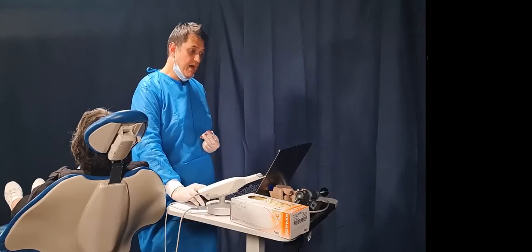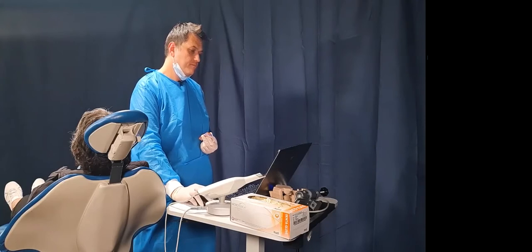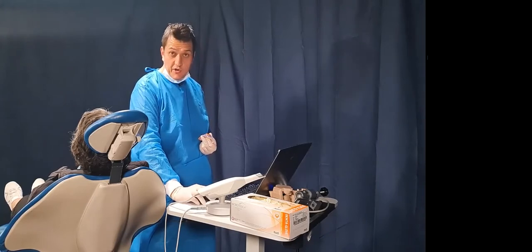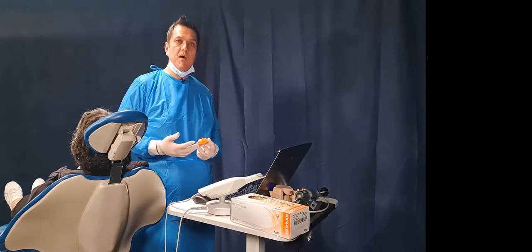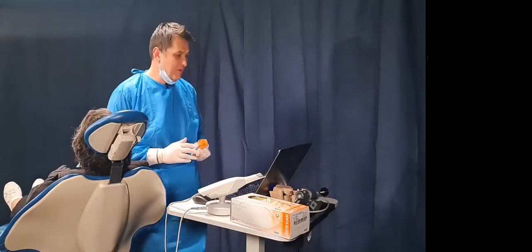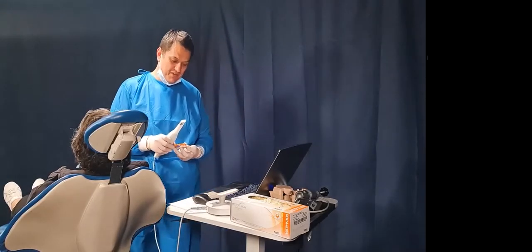I'm just going to delete my upper scan. Okay, and I'm going to select the reference denture icon on Trios. Now, I believe that the scanner is optimized for the indication that you're doing. So it is a good practice to actually follow the manufacturer's recommended protocol. So I've selected that now on our screen, and I'm going to start to scan.